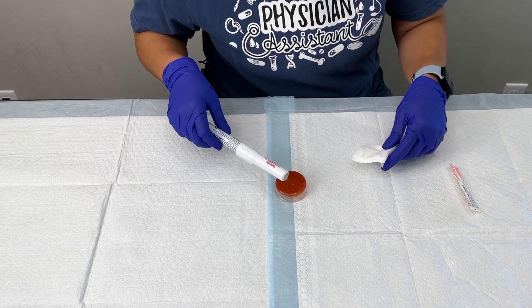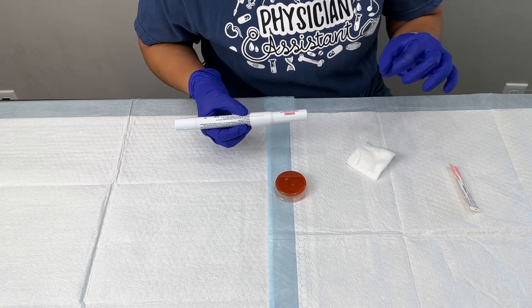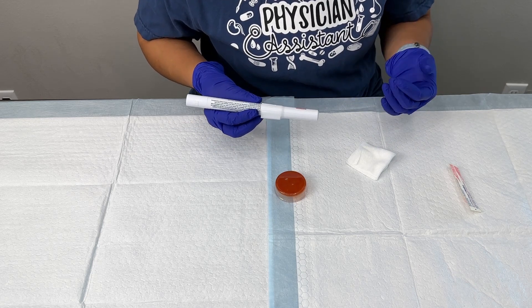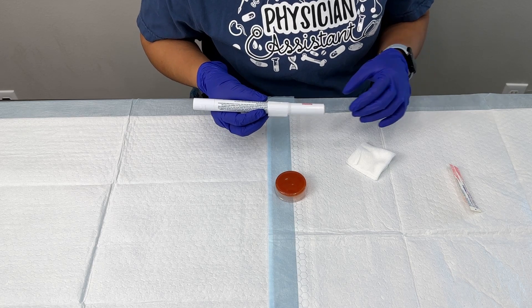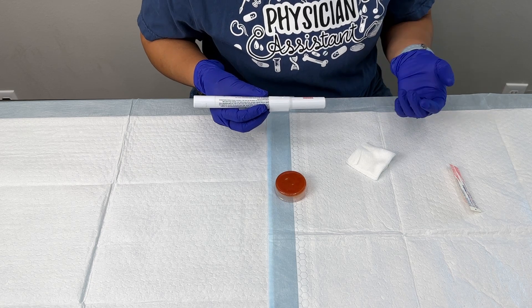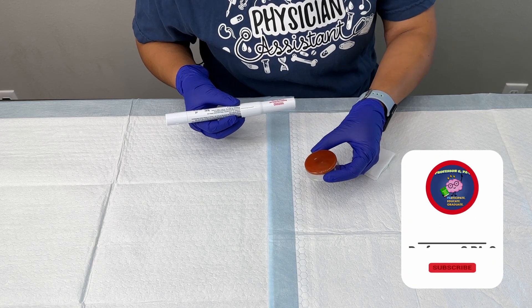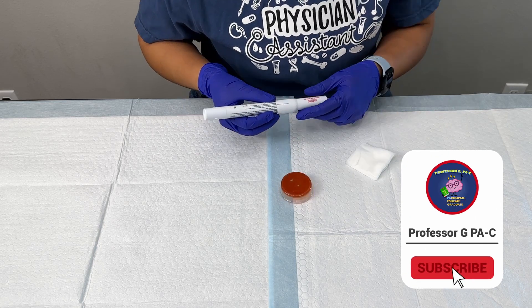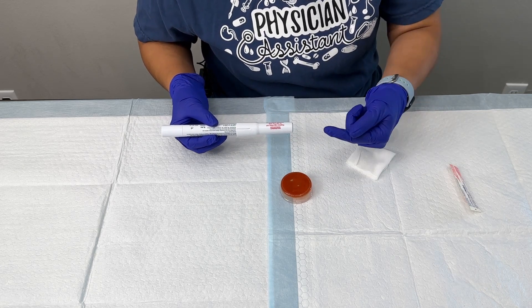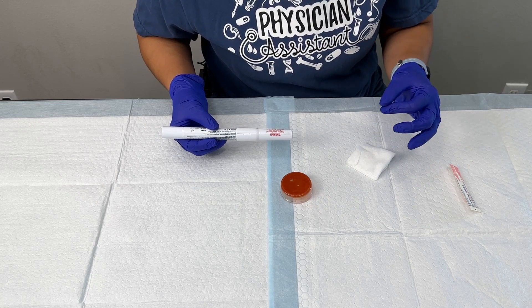Once we have the skin nicely cleansed — this procedure, we're not actually going to go through the nail all the way and touch the nail bed, we should definitely try not to do that. Because of this, you don't necessarily have to put a digital block in. If your patient is really uncomfortable and you plan on doing anything else, then you might want to put one. Make sure that when you examine the nail bed there are no lacerations that require repairing. If you're concerned that the patient has a laceration of the nail bed that needs to be repaired, you're going to have to remove the nail and explore that further. This is just a very simple subungual hematoma.